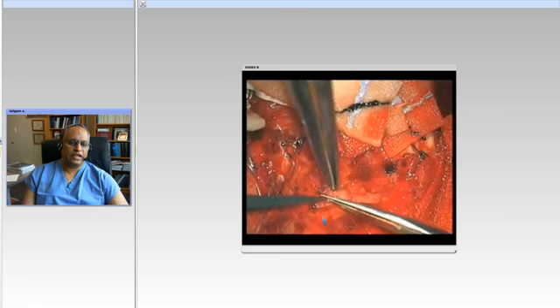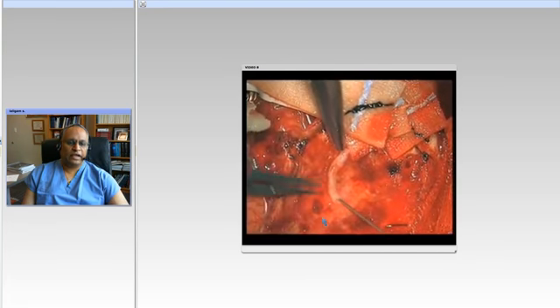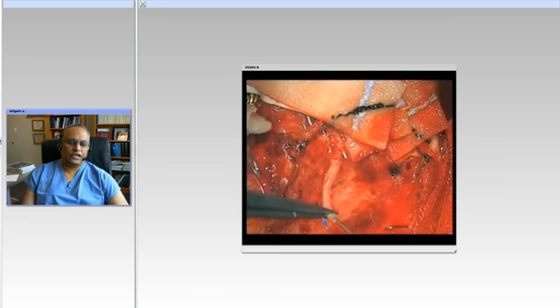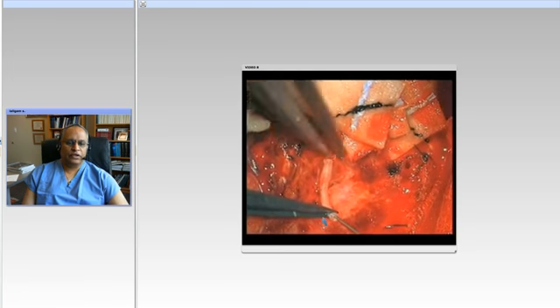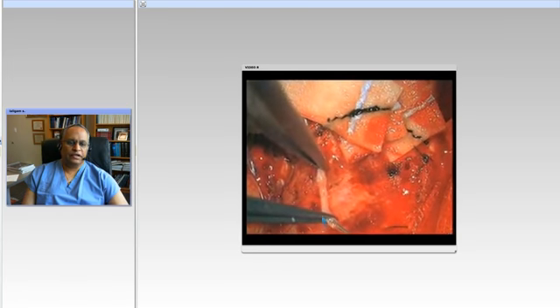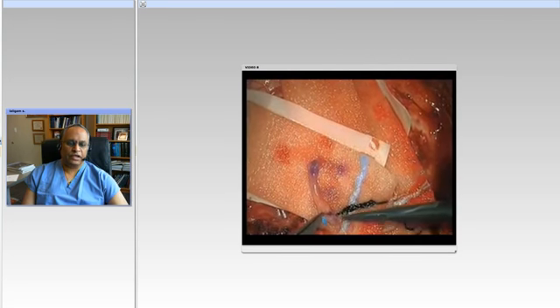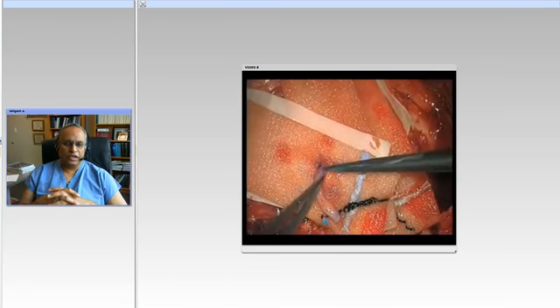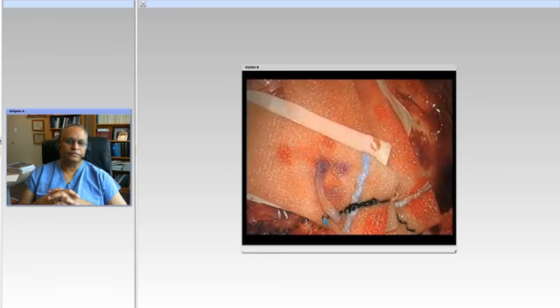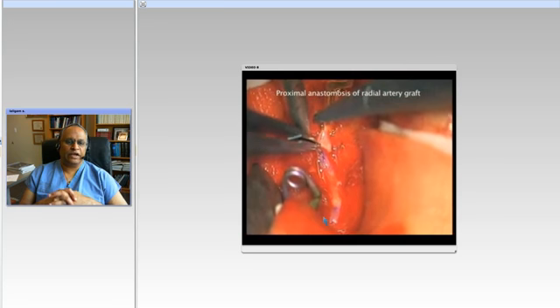We are taking the adventitia and accompanying veins away, and we are just distending it a little bit, and you will see me just using a little pressure to distend it, and then we'll transfer it intracranially and essentially end-to-end suture on both sides. So you can see it's a pretty tiny radial artery graft. So here's a proximal anastomosis.